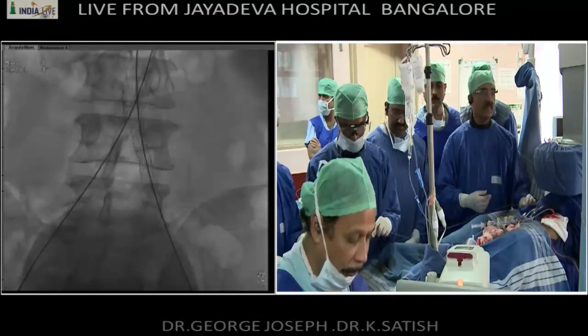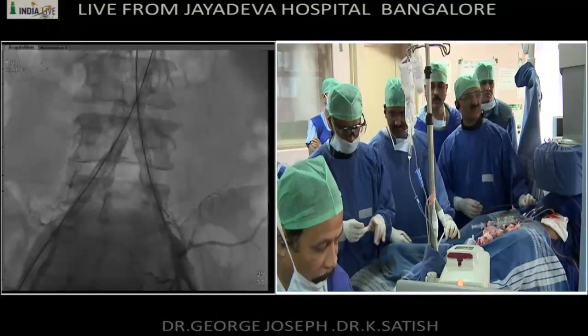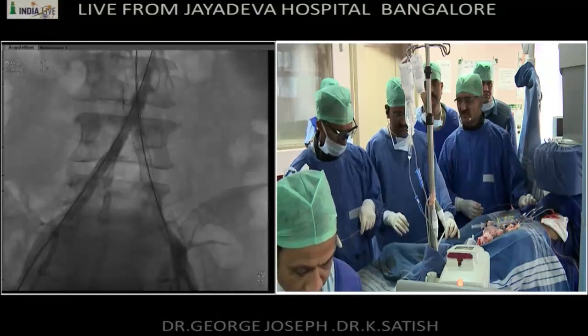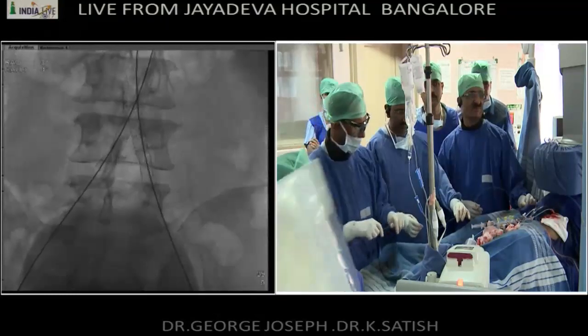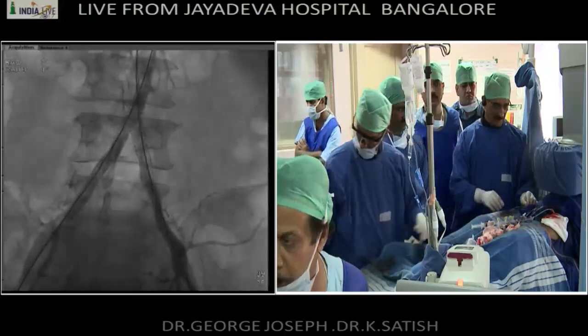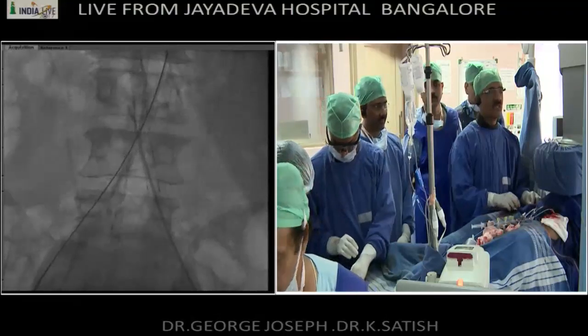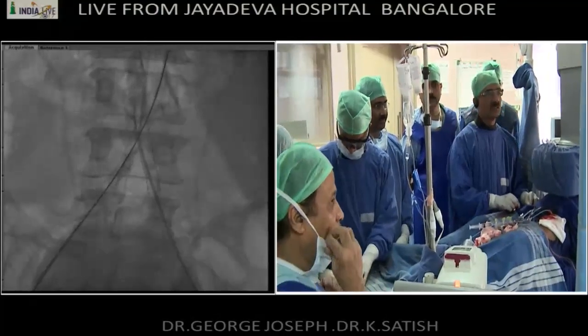Ideally, I would have preferred a self-expanding one. Were both the iliac stents 8 millimeter in diameter? Yeah. Now he's taking 7 millimeter. Yeah, but the right one doesn't seem to be expanded as much as the left. So maybe it's around 7, so we can post-dilate.